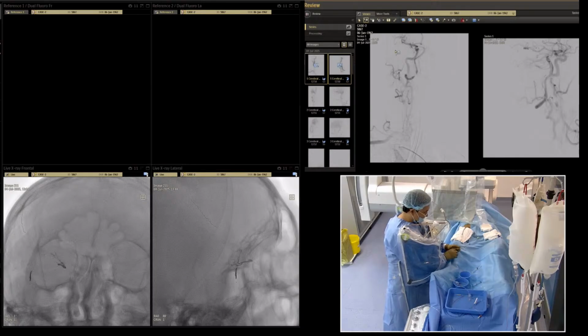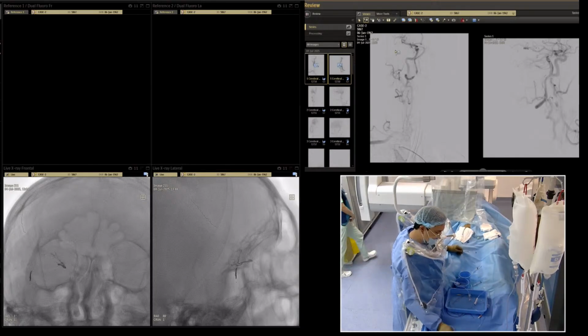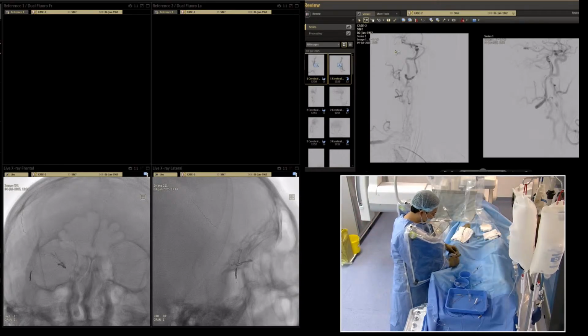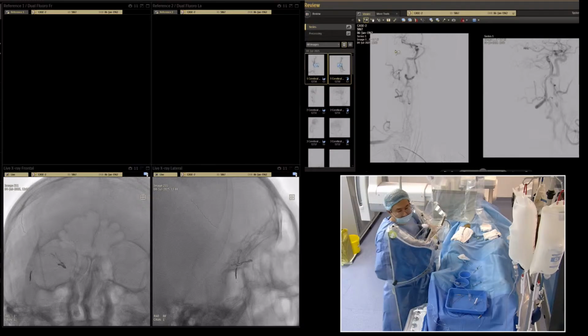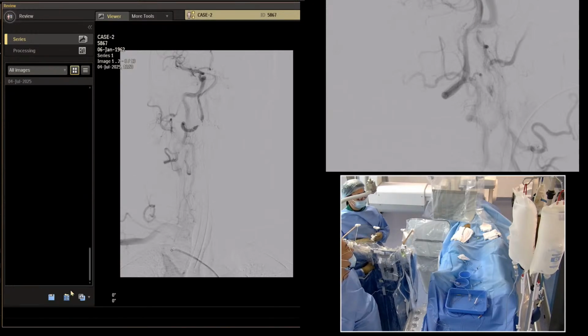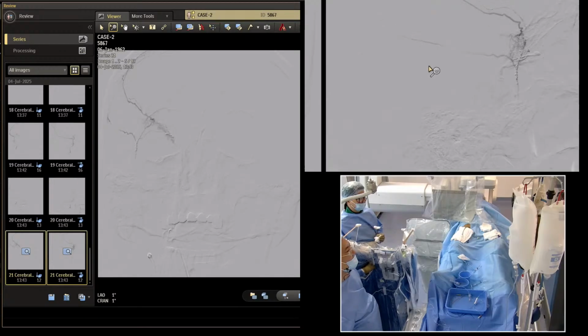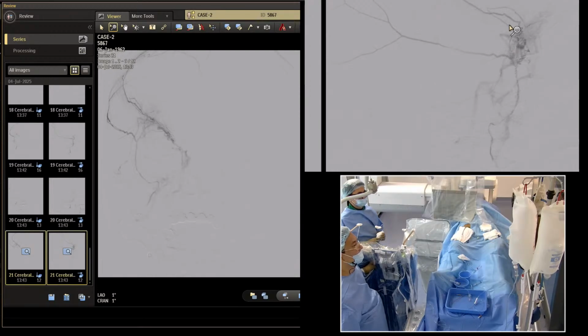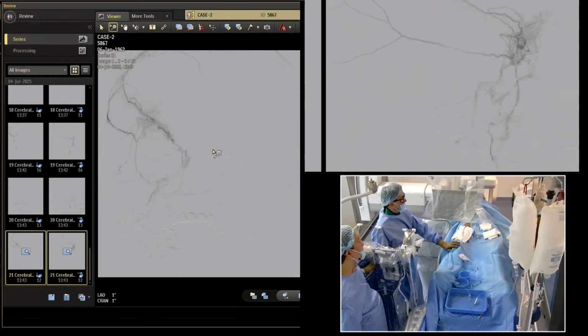Deeper narcosis, and dexamethasone 12 milligram. It's quite painful procedure, and the only point we have is this branch supply, but this is also occluded and isolated. We can use it. And this is a vein. This is a vein. And this is a vein too.